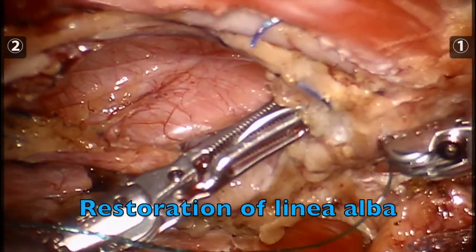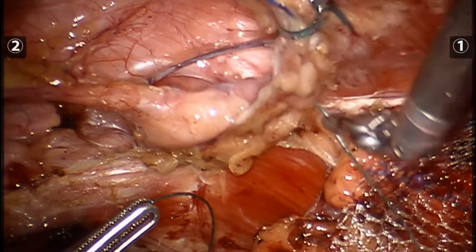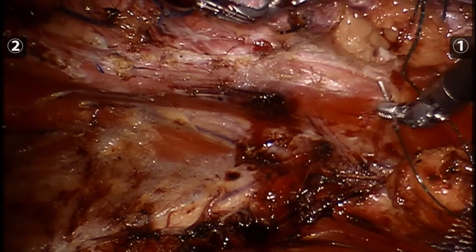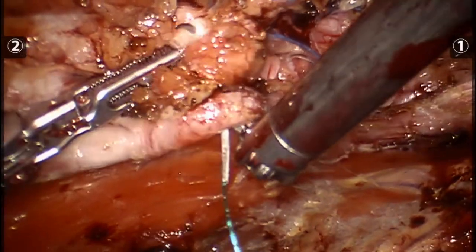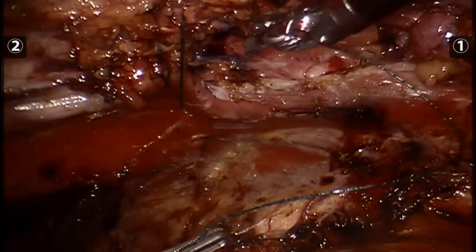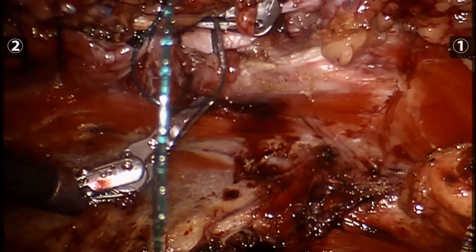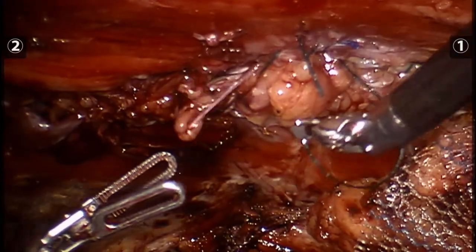The linea alba is restored by re-approximating the anterior sheath. We take a bite of the hernia sac and subcutaneous tissue in order to incorporate that within our defect closure. This will hopefully obliterate the dead space anteriorly, reducing the risk of seromas. We have decreased pneumoperitoneum to eight millimeters of mercury. Here you see the linea alba is restored and the rectus is back to where it is anatomically and physiologically supposed to be.